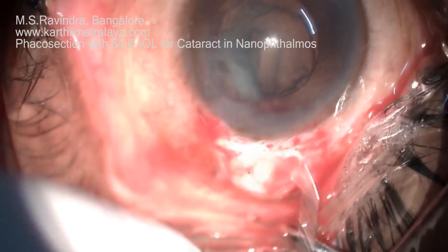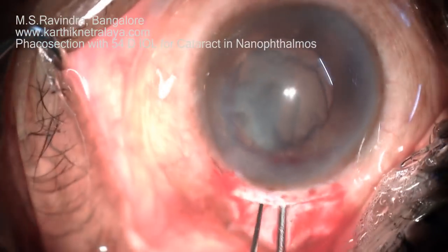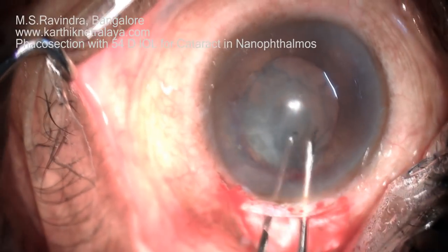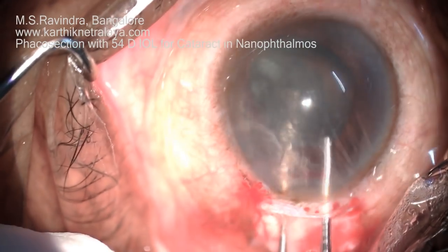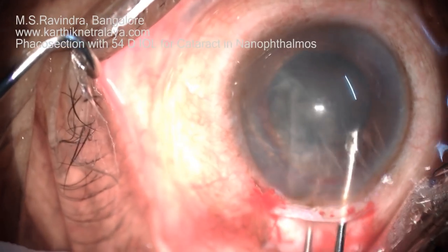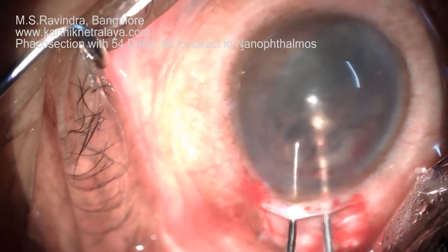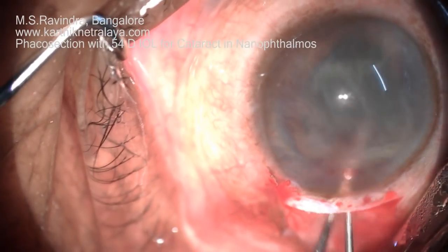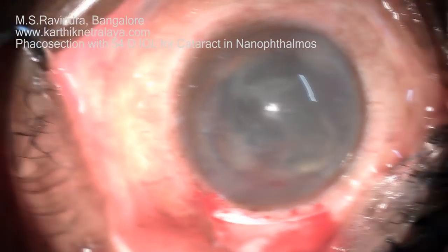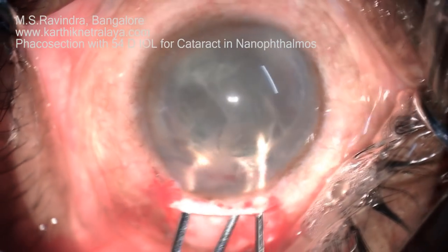Viscoelastic is being continuously injected throughout the next few steps of cataract extraction. The nucleus is prolapsed using a bimanual rotation technique. The best viscoelastic to protect the endothelium is dispersive viscoelastic of hydroxypropyl methylcellulose, which is continuously being injected.